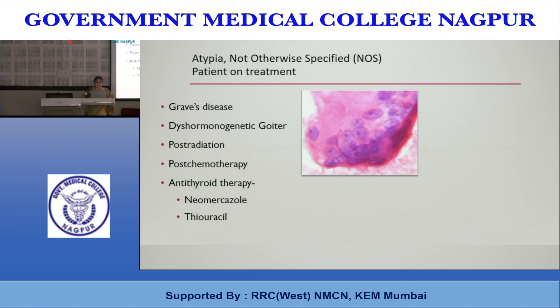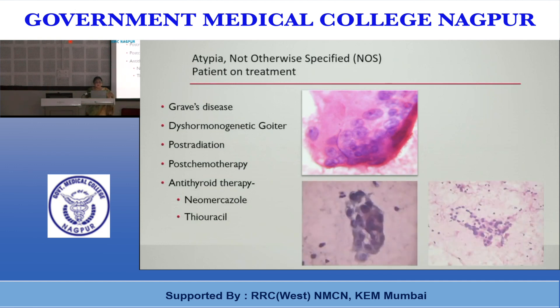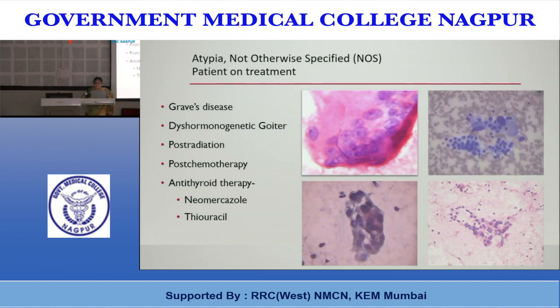In one picture, very large cells with prominent nucleoli are seen, but this pattern of nuclear atypia does not raise concern for papillary carcinoma and is best classified as NOS. The patient had a history of radioactive iodine treatment. Another patient treated with neomercazole for three years showed marked atypia in the form of nuclear enlargement and hyperchromasia. Always interpret such marked focal atypia in the light of clinical history and proceed to a repeat aspirate.